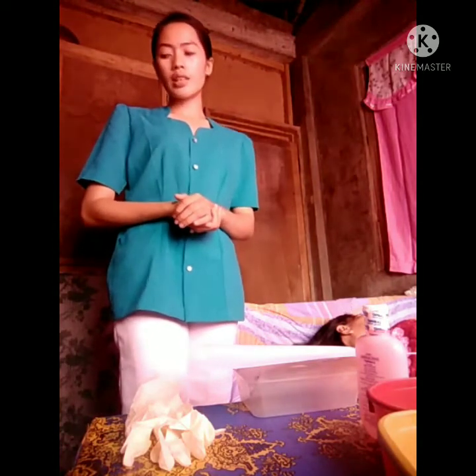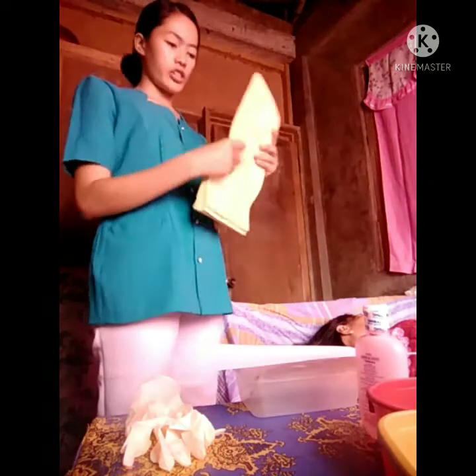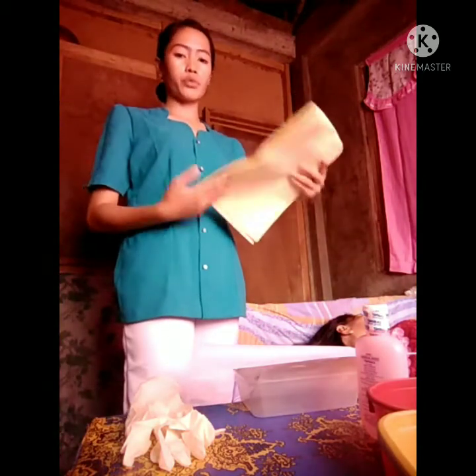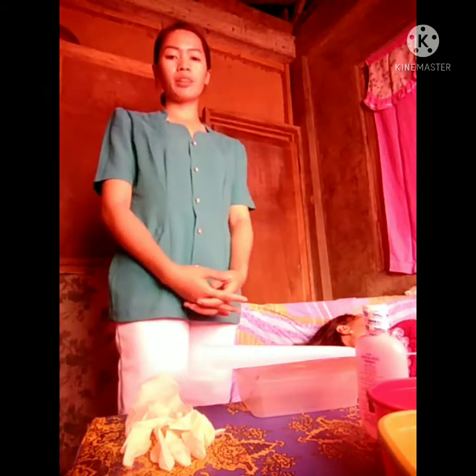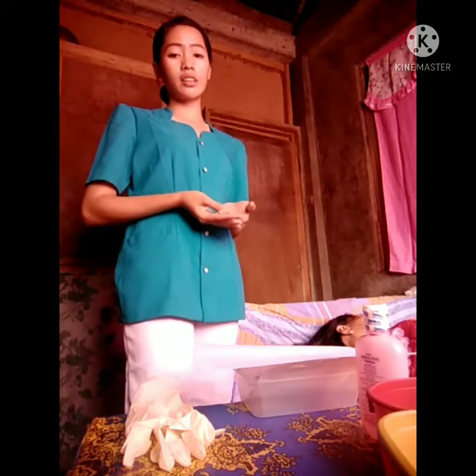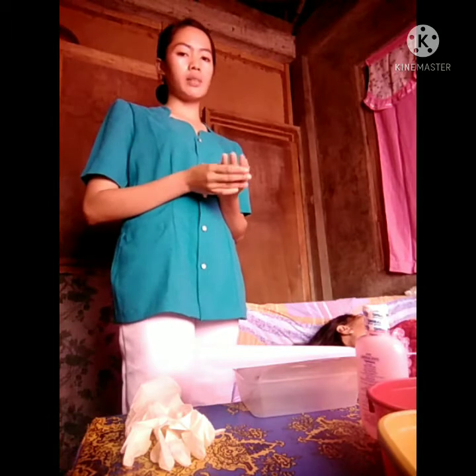The first step is to review the medical orders for the dressing change procedure. So we need to check first. After checking the medical orders, the next step is to explain the procedure to the patient or client, and then make sure to remind the patient not to touch the wound area or the sterile supplies so that they will not be contaminated.